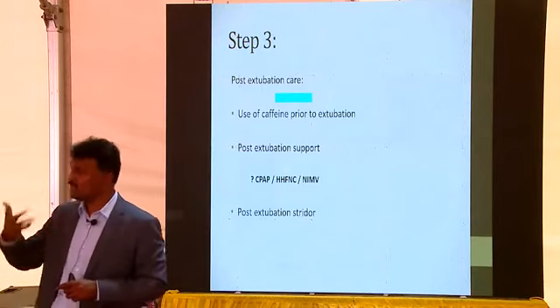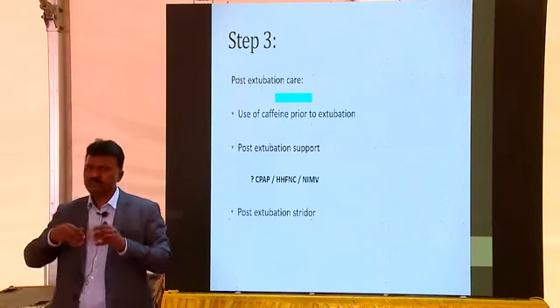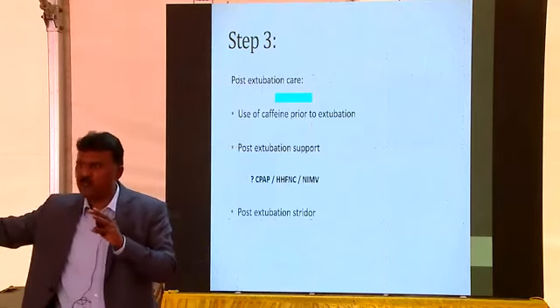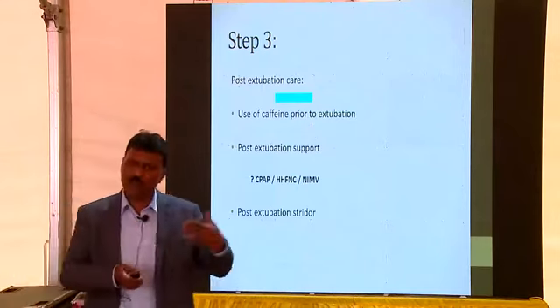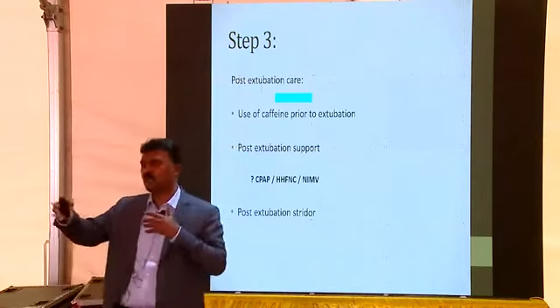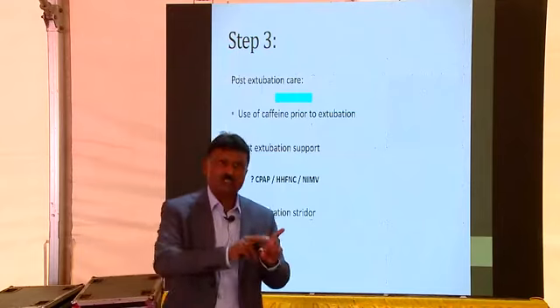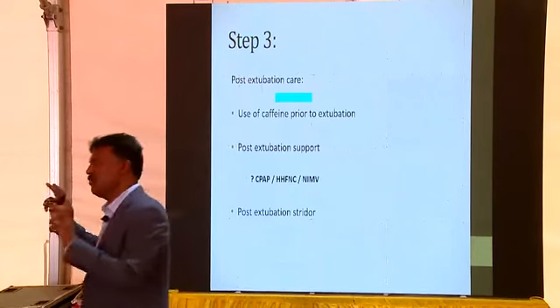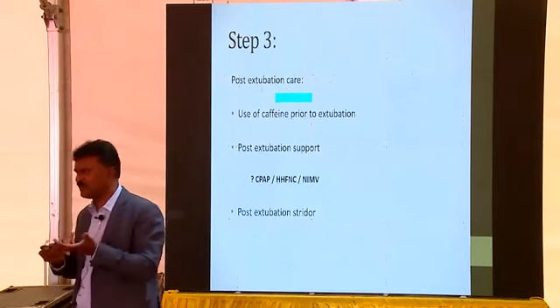You are worried about high pressure and those pressure jets being directed. Maybe CPAP is a better mode. If your babies are on CPAP and you do not want to intubate, can you try this NIMV? You can try, but using a ventilator which can synchronize would be a better thing, because we have not had very good experiences.